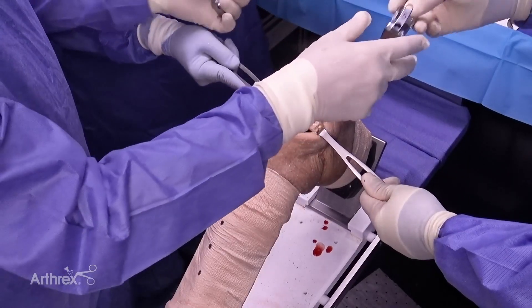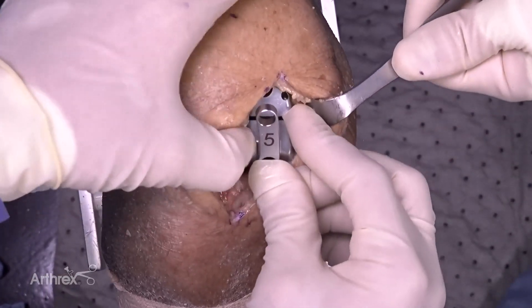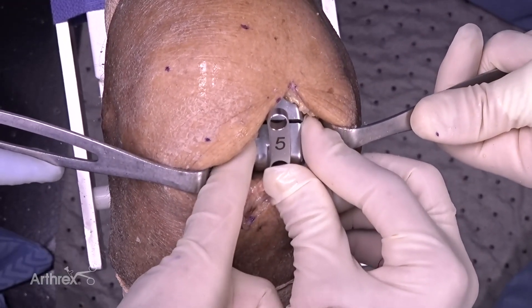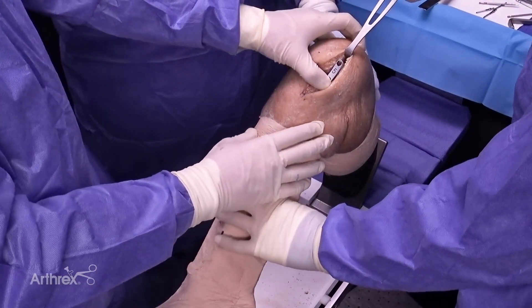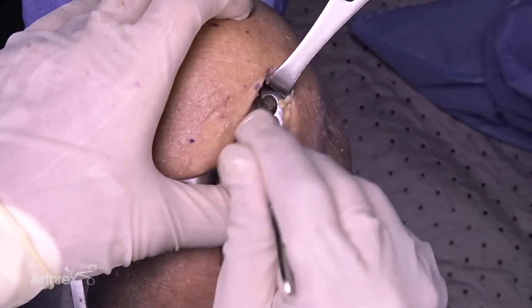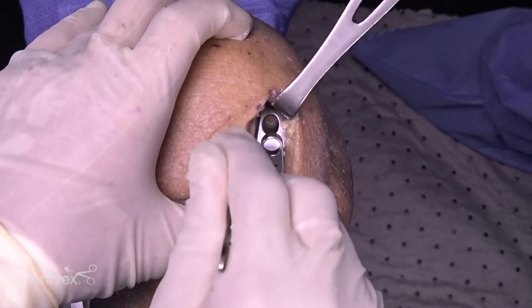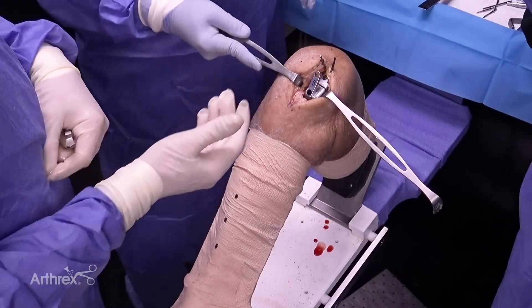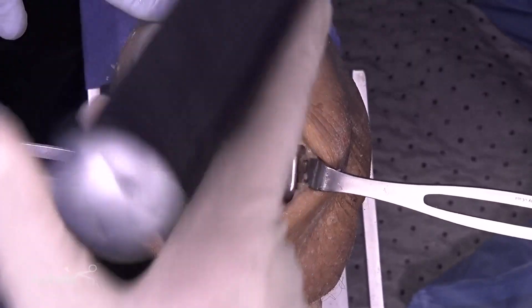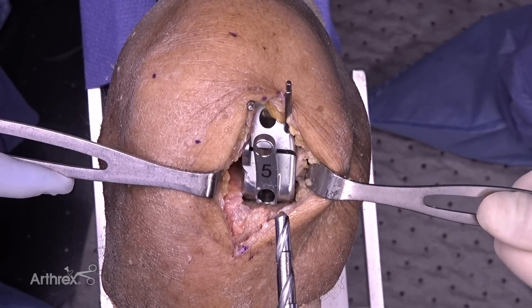Now it's just a matter of preparing and placing the femoral and tibial component. I'm going to place a size 5 to start. It fits right in — centered right on my condyle. I also want to confirm a couple millimeters of cut bone anterior to the guide, which is very important. You don't want oversize; you want a little bit of bone remaining. This size 5 looks really good. Two things this guide requires: a drill for lug holes and a saw blade for chamfer cuts. Always drill your lug holes first — once you've made your chamfer cut, that piece of bone is missing and the guide will not be as stable.